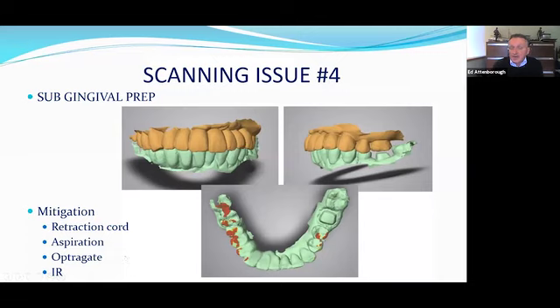And we can see some challenges here that also are helped by the move from monochrome STL non-texture scanning to PLY scanning, because the color and texture information that you're getting from the recording gives you extra pointers to where the margin might lie. It's easier to see in color and in change in texture the difference between tooth and soft tissue than it is in monochrome.